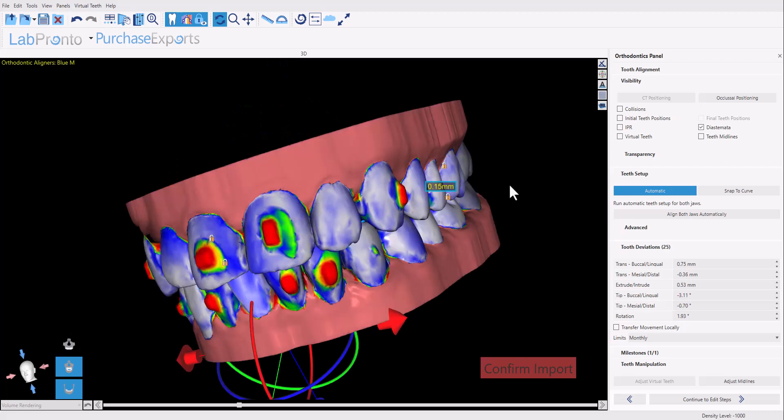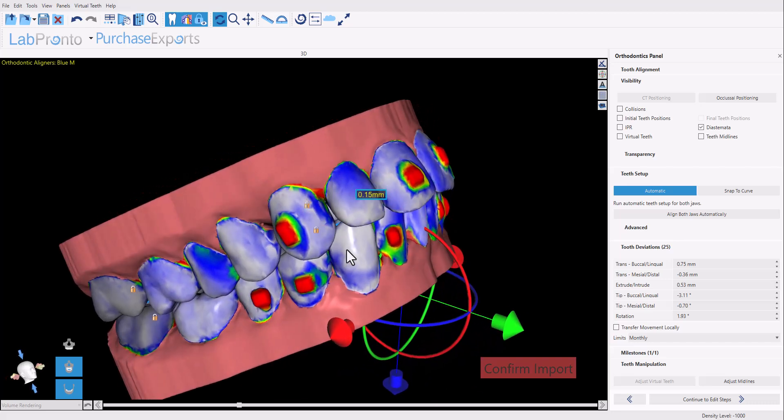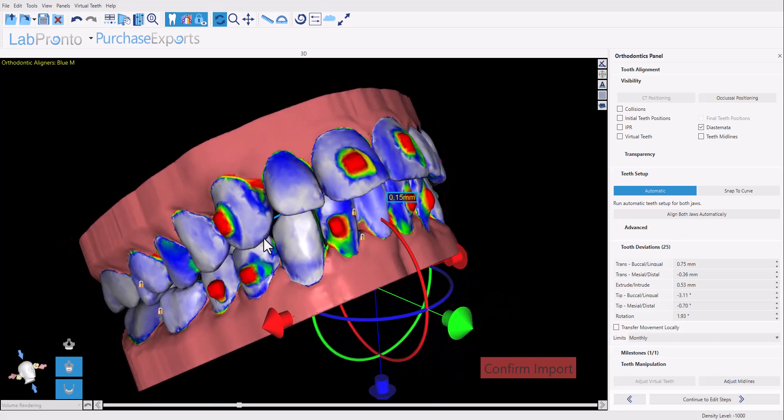Once we've reviewed the blue coloring and confirmed the correlation and alignment between each tooth in the new data set to the original data set, we click the button confirm import.